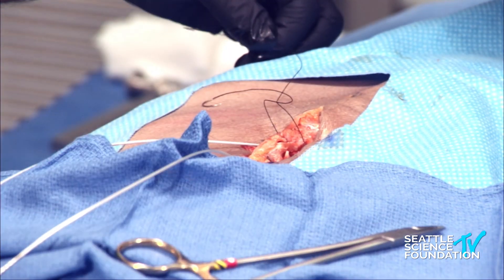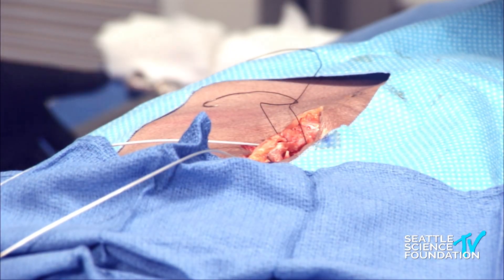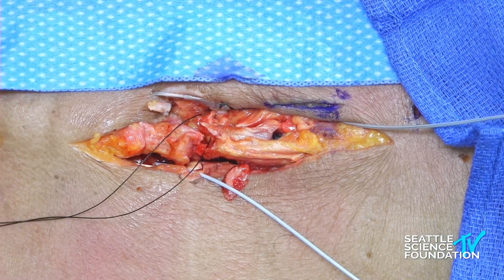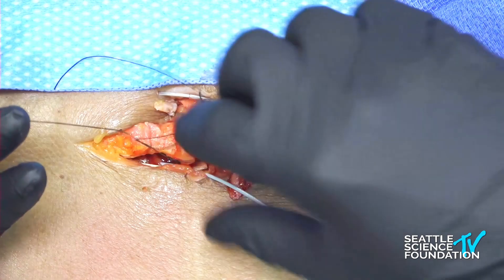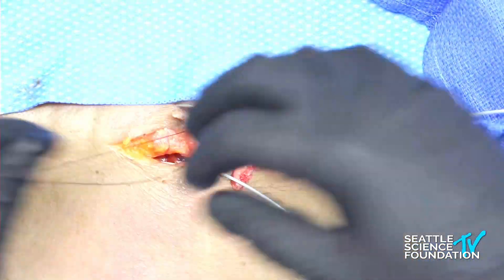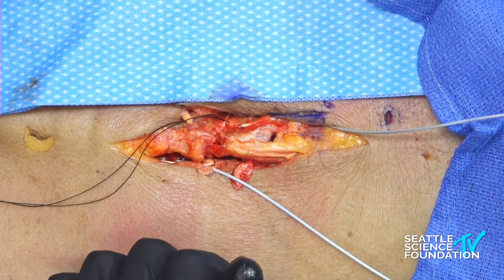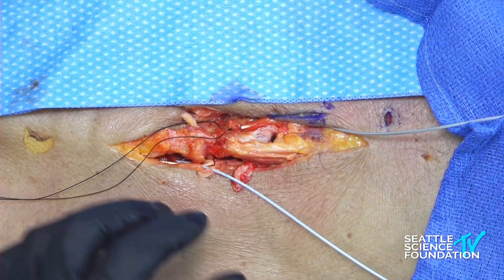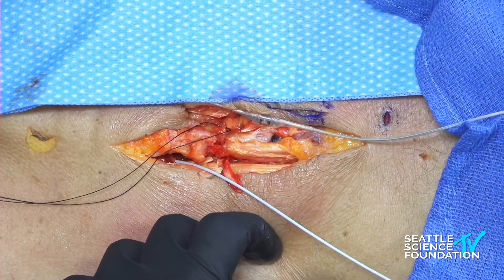You can do a chest tube tie or suture the lead on one side, then do the same on the second hole of the anchor just to keep it secure. Once you've anchored the lead — I'm just showing one here — once you've anchored the lead into the skin and you've decided which side the patient wants the battery on, you'll actually measure out and map where the battery would go. Take the template, put it either here — some people prefer it in front, I usually put it right next to the incision.